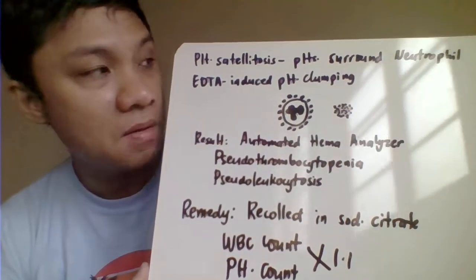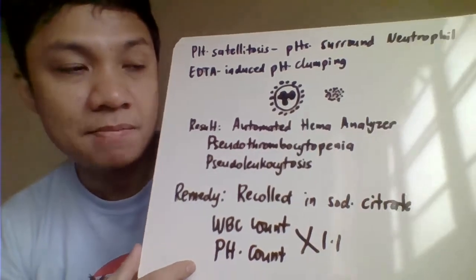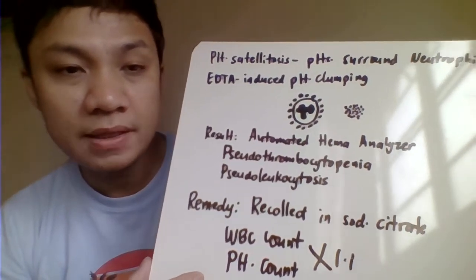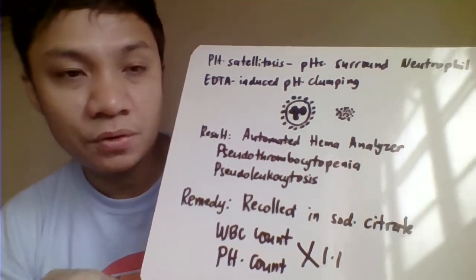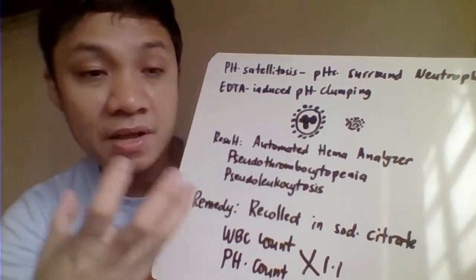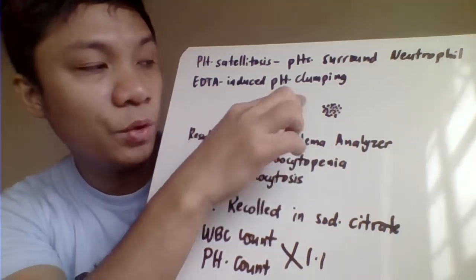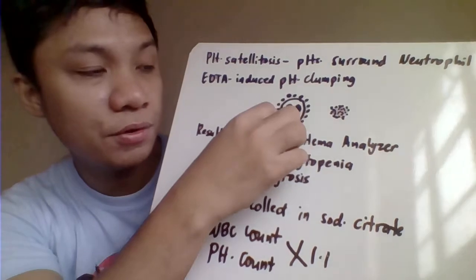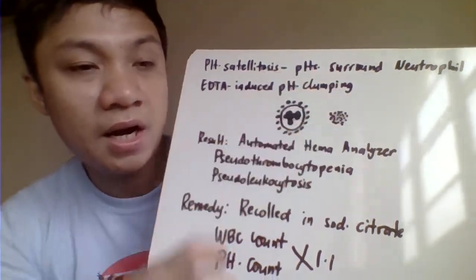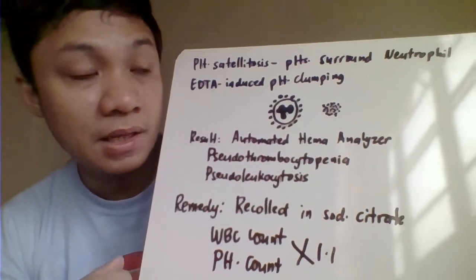If you have platelet satellitism or platelet clumping when you perform the CBC with the automated hemanalyzer, note that the automated hemanalyzer identifies blood cells based on particle size. Small particles are identified as platelets, and WBCs are identified as having a bigger particle size. When you have platelet satellitism, the platelets would be identified as WBC because they form a satellite around the neutrophil. The same is true with platelet clumping. Since they form a bigger particle size, the hemanalyzer does not recognize them as platelets, but rather interprets them as another cell in the body.